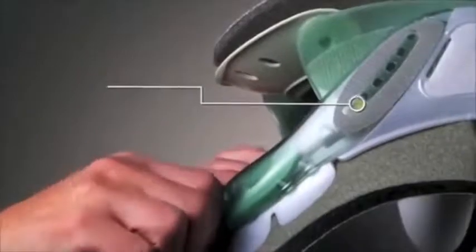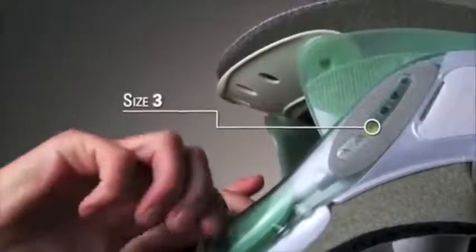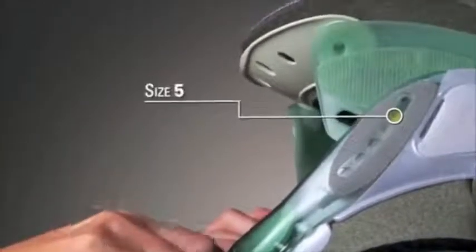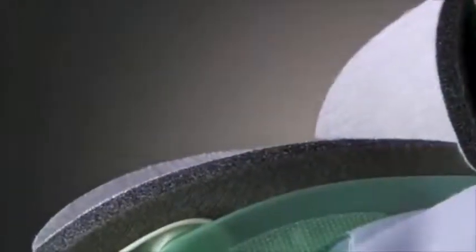The Vista eliminates the need for sizing methods of any kind. The innovative design allows the practitioner to simply adjust the collar on the patient for a perfect fit every time. The patented design disperses pressure, reducing the possibility of skin breakdown. The proven Aspen cotton-lined pads complete the system by wicking moisture away from the skin.